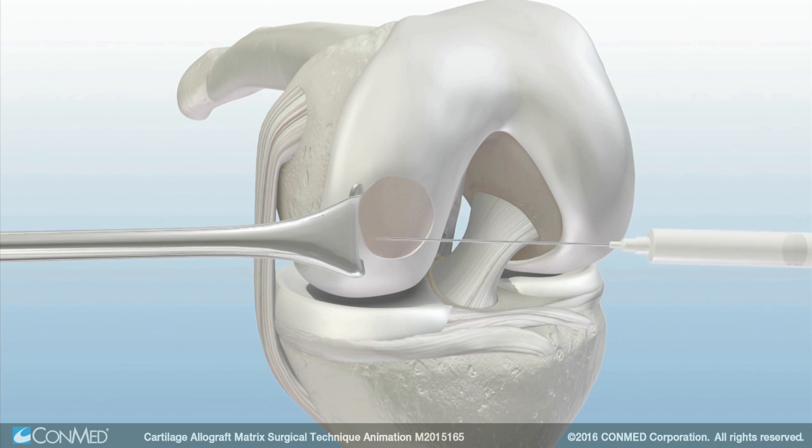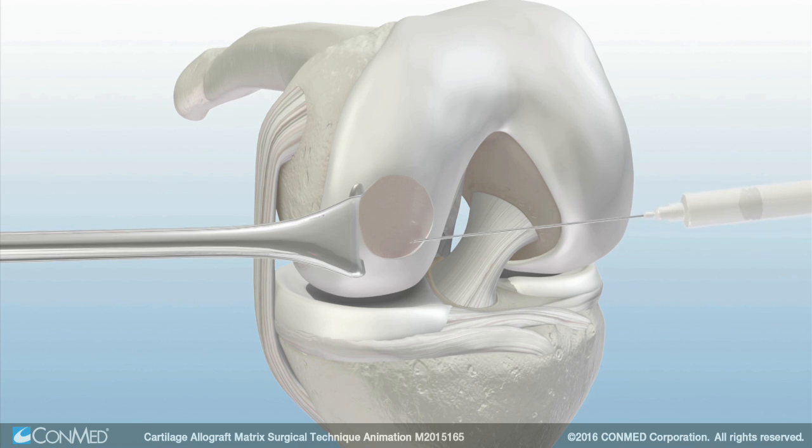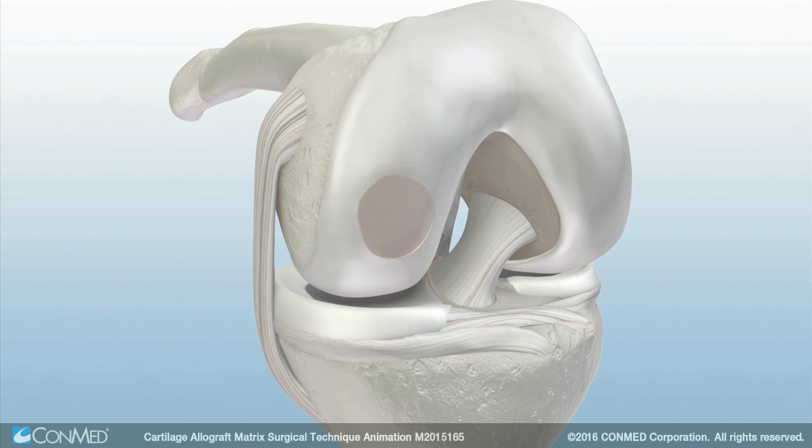Apply a fine layer of fibrin glue solution over the top of the cartilage allograft matrix, using just enough to lightly cover the defect. Avoid excessive application as it will cause the construct to sit too proud.